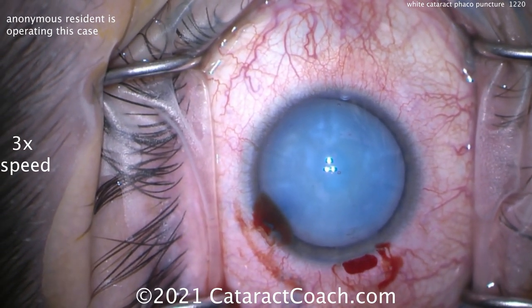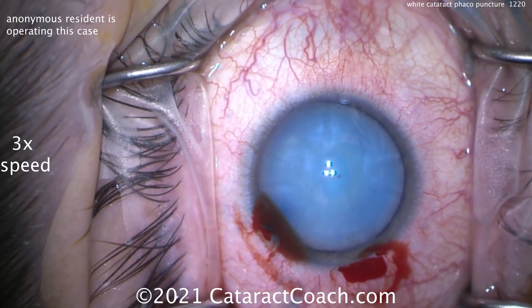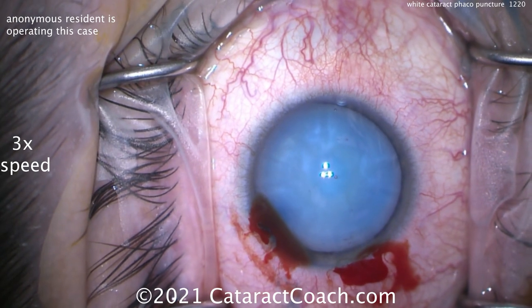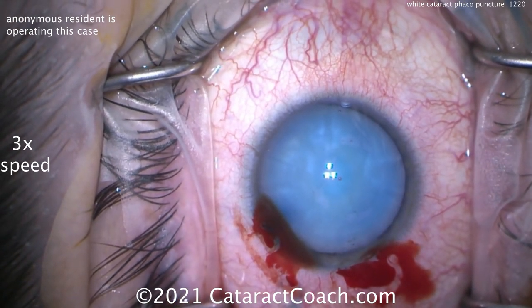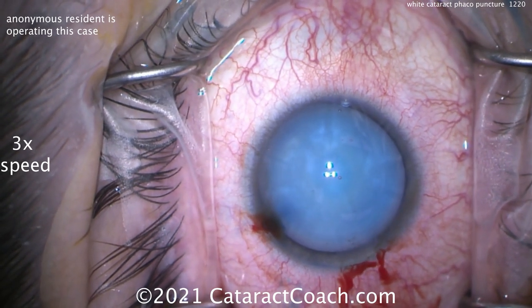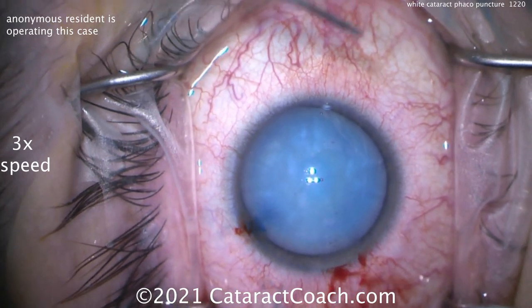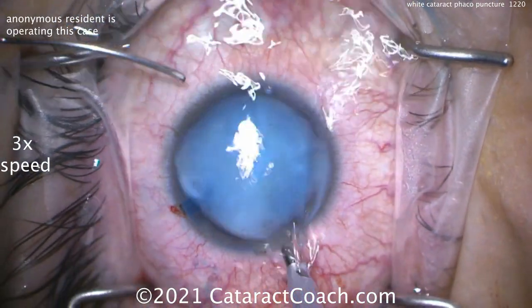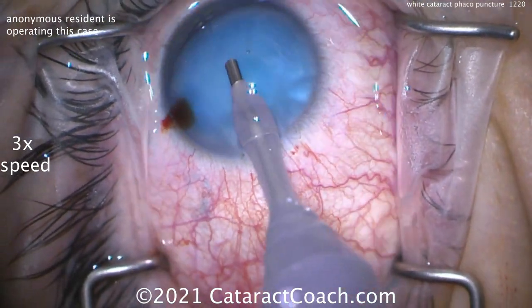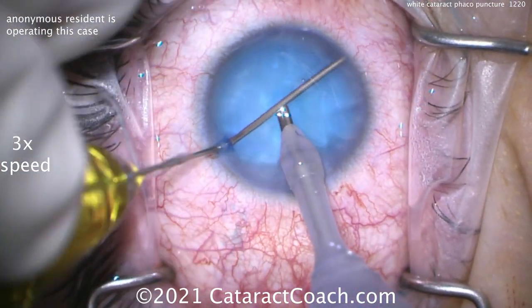So that's high — or bottle height if you're using an older machine, at least 120 to 130 centimeters. We're going to use the FACO probe. You don't need a lot of flow, you don't need a lot of power. Very little power is needed to puncture that lens capsule from the center. Just preparing a few things here, getting ready. FACO probe going bevel down, and you're going to barely tap into position three.